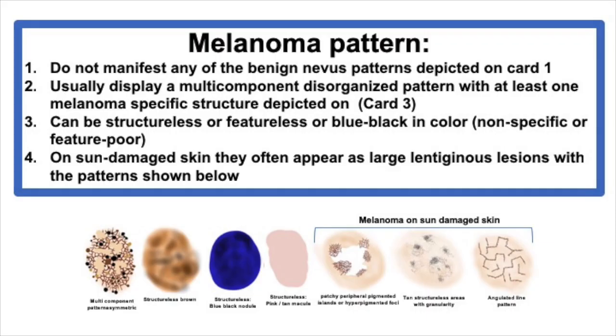Now, there are a few melanomas that actually appear organized. We'll talk about them at the end.